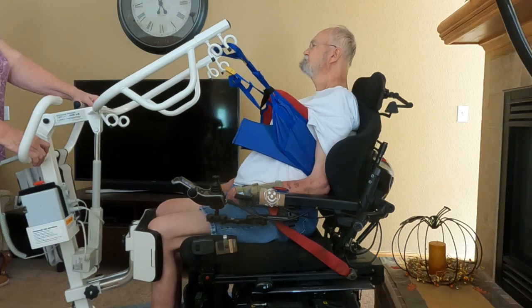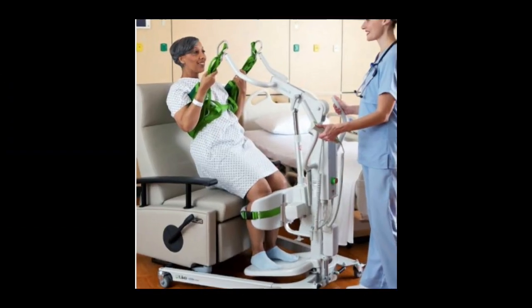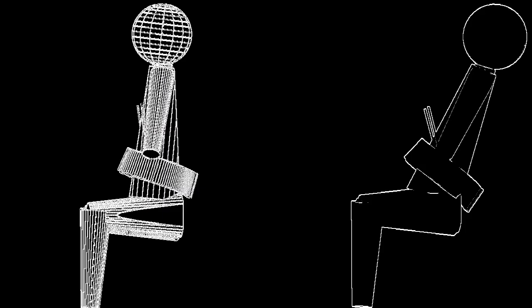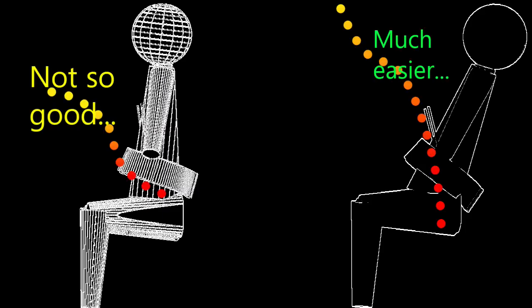When the lift is started, it's important that the patient lean back as far as possible into the sling. This will assure that the patient will be lifted in a comfortable arc, lessening any unnecessary stress on the upper legs and shoulders.